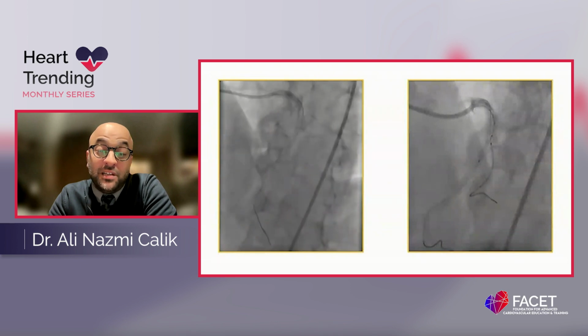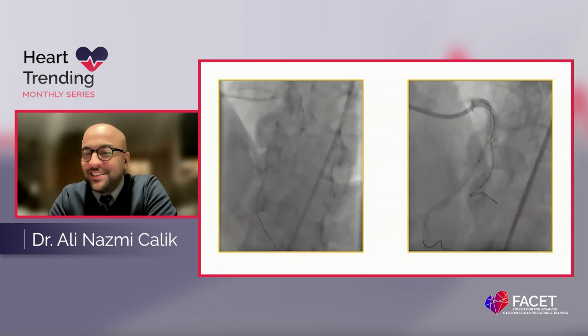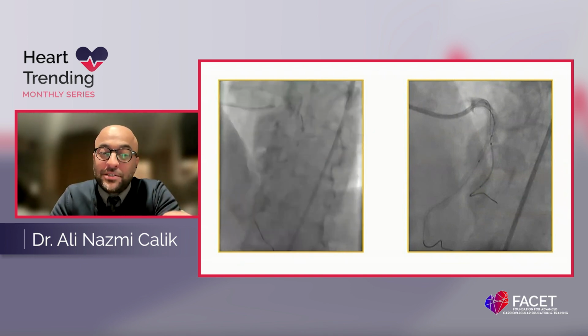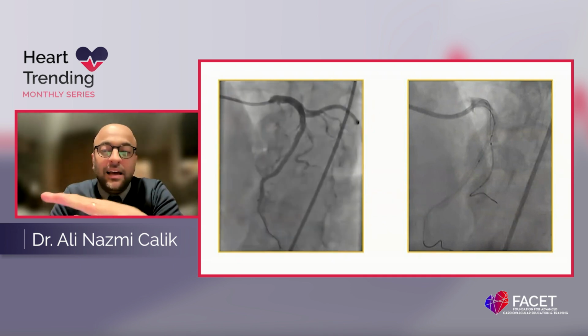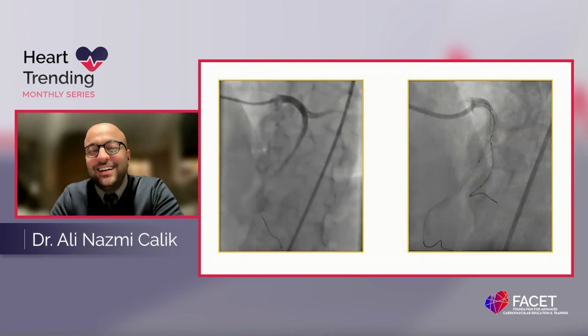But at this time, inadvertently, the side branch guide wire is gone. Oh my God, that's a nightmare. The side branch ostium is dissected after kissing. Yes, this is a true nightmare, and you know this always happens in the middle of the night. Yes, it has to be.